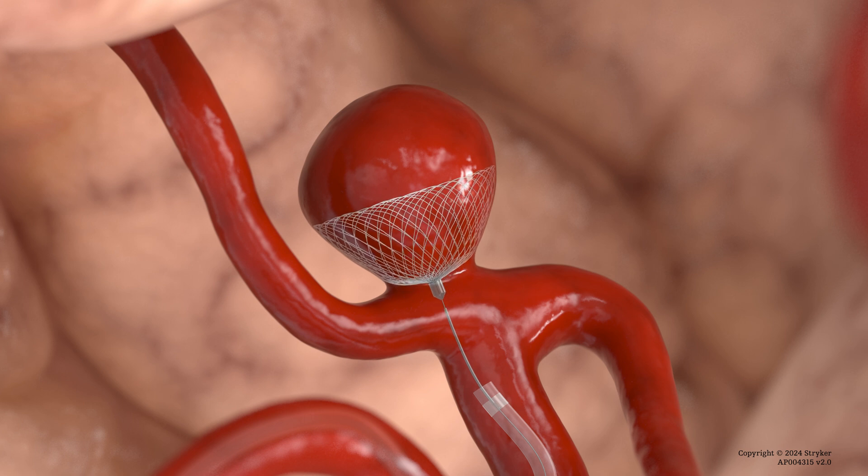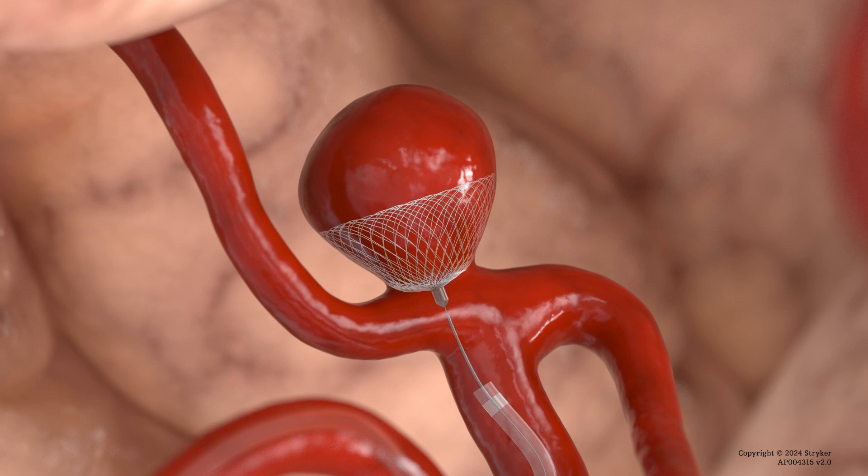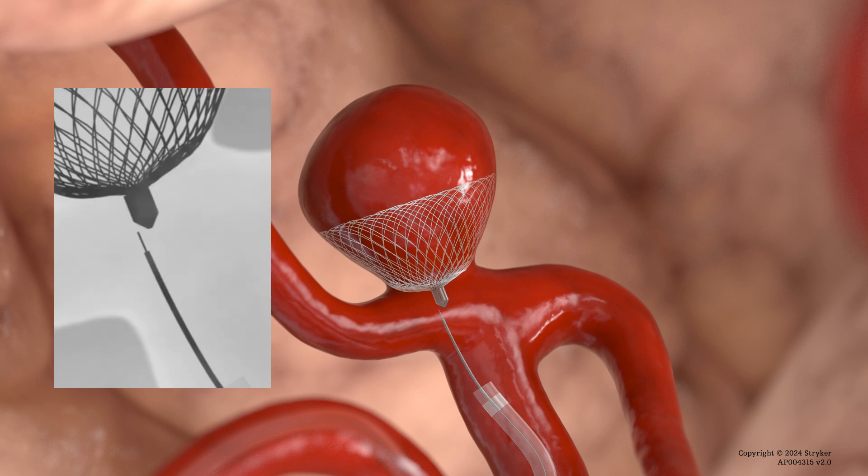Apply a light forward pressure to the pusher wire and look for bowing of the pusher wire to confirm distal stability. Once the device position and stability have been satisfactorily confirmed, the contour device can then be detached using a commercially available electrolytic detachment system.